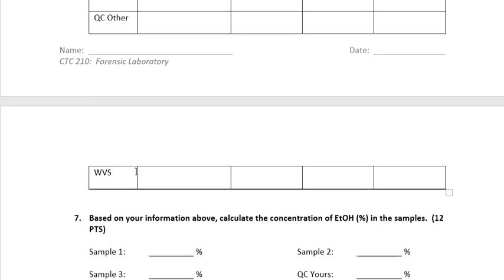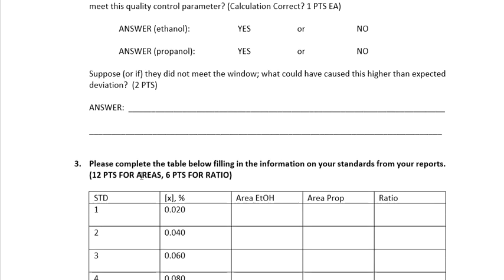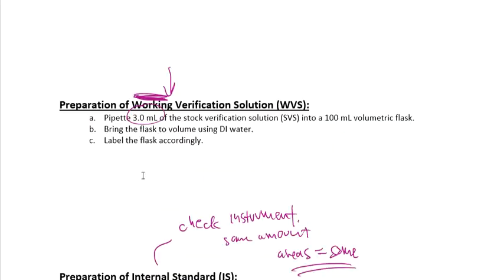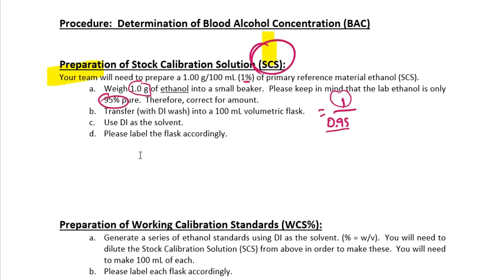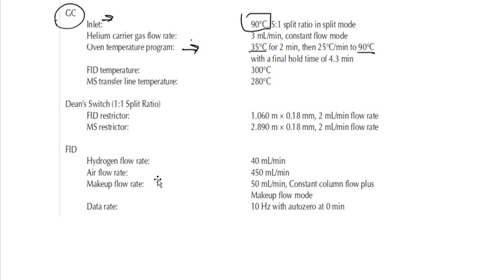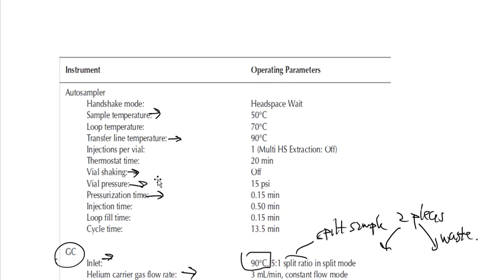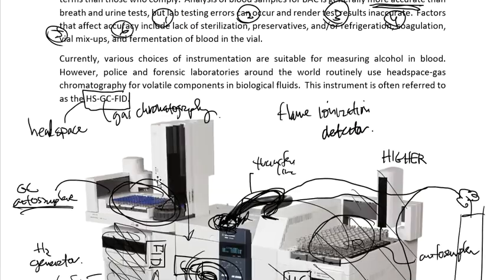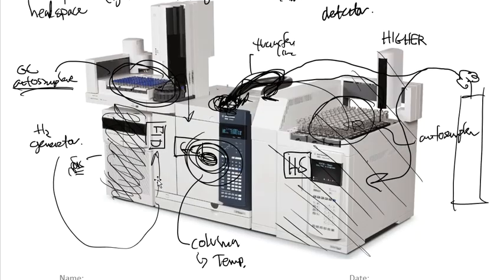All right, guys, so that's it for the blood alcohol content lab. There's a lot of things that are going on. There's a lot of new bits and pieces. We got a complicated piece of machine. We have all of these standards for quality control purposes that are going to be involved in this process. And these samples are going to be loaded up on one day, and you will not get your data for that day. This will be a process for the machine to analyze. I think each one of them takes about 15 minutes in total, not including a total cool down and heating up ramp that goes along with each one.